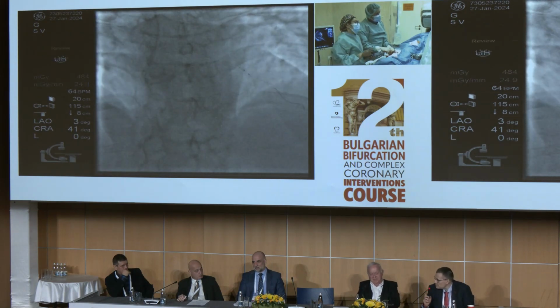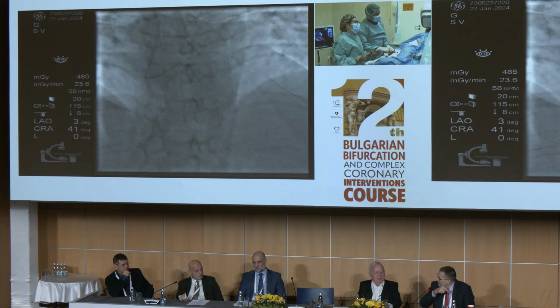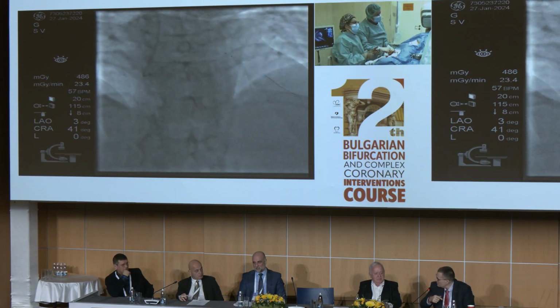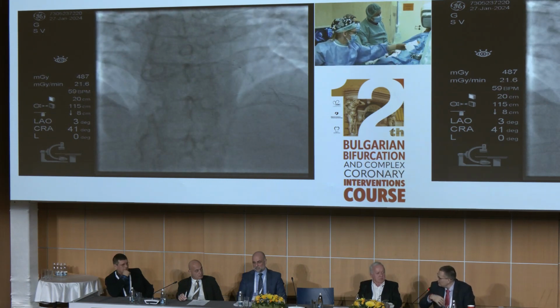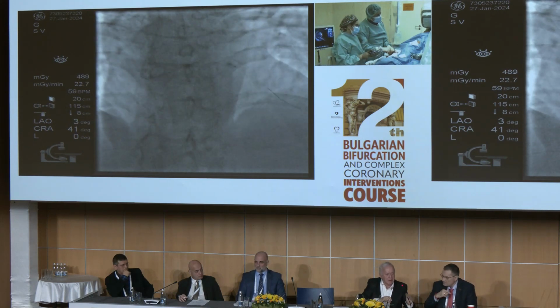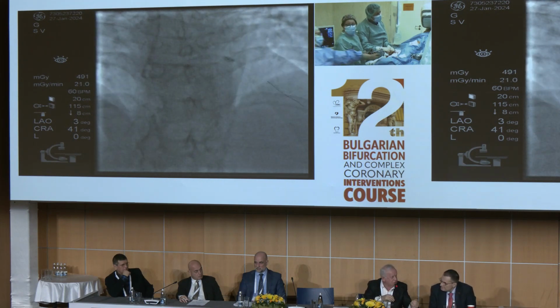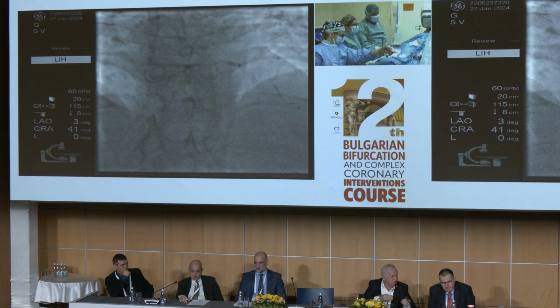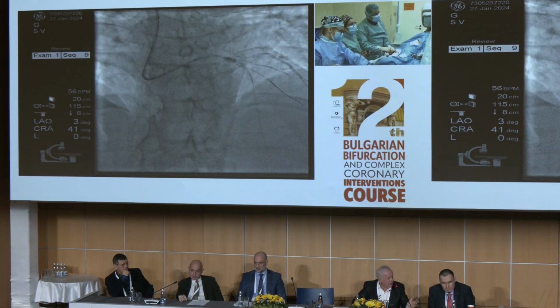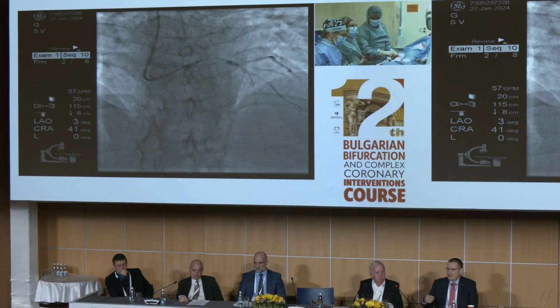My only concern in this case is that practically they did direct stenting and simultaneously dilate. Maybe we can take a 4 millimeter stent. I mean that this is direct stenting and they really have to dilate, not only implant the stent. Even for pre-dilatation of a bifurcation, you can use two balloons, one for the distal, one for the proximal. Of course, the distal one cannot reach the diameter of the proximal, at the risk of blocking the side branch.